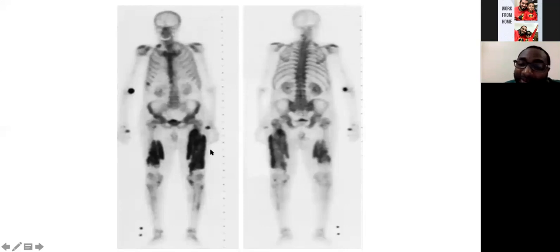So again, in these circumstances, without a history, without an X-ray, without a plain radiograph, it is very difficult. The reason I'm showing you this is that bone scan is very sensitive, but you need additional information. And please don't be afraid to ask for additional views or other modalities. If you are not certain, you can say, please, I would want to see the X-ray or the radiograph of this patient, if it's available. And immediately you will see in this patient, it was a heavy calcification, okay?